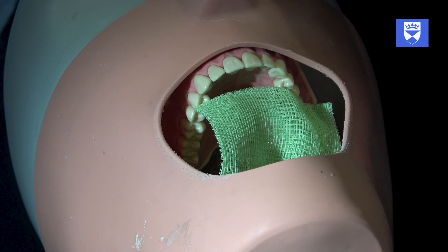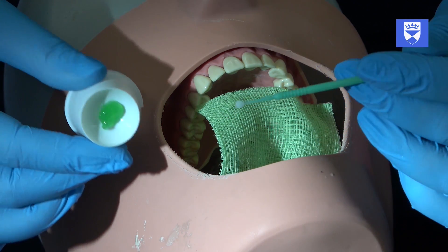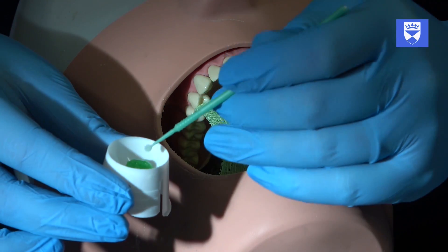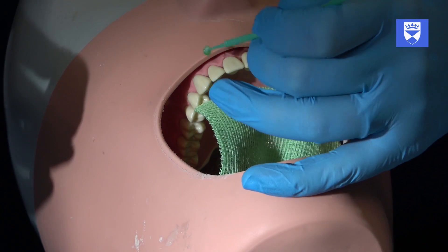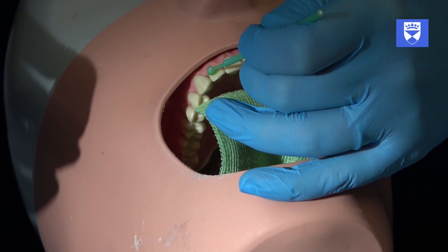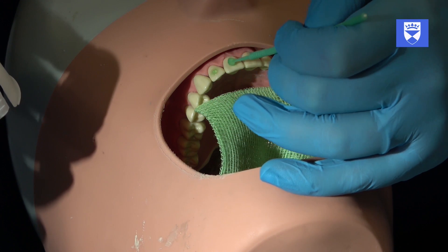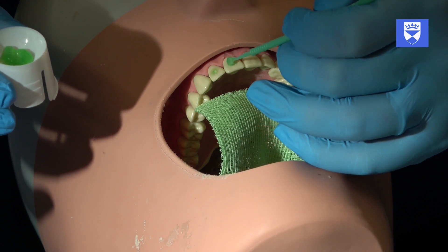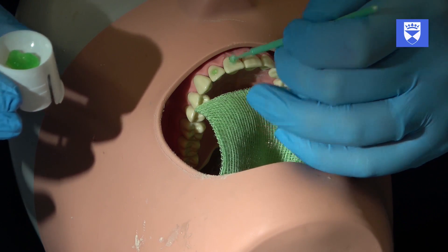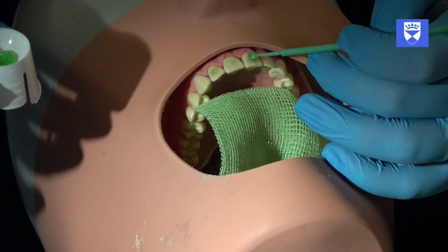Isolate the teeth with a cotton wool roll and dry the teeth. Ensure that the cotton wool rolls are controlled when in the oral cavity. Etch and bond the labial surface where the splint is to be secured, taking care to only etch and bond the minimum amount of labial tooth surface necessary to effectively affix the splint. The exact details will depend on the bonding system you are using — refer to the manufacturer's guidelines for determining these times.